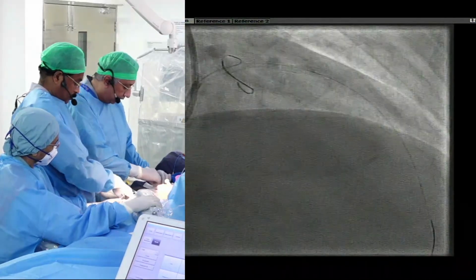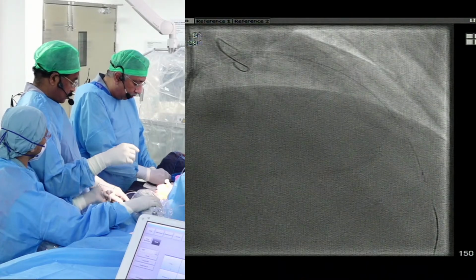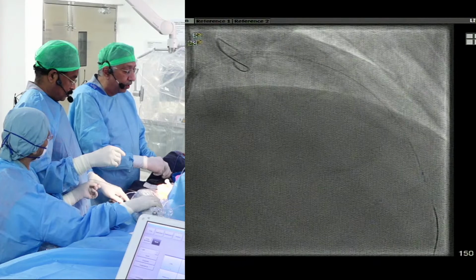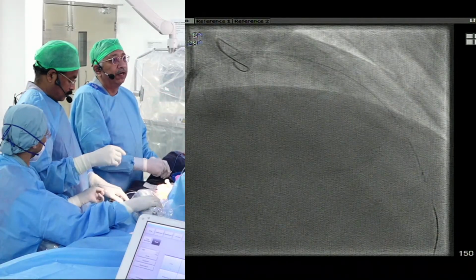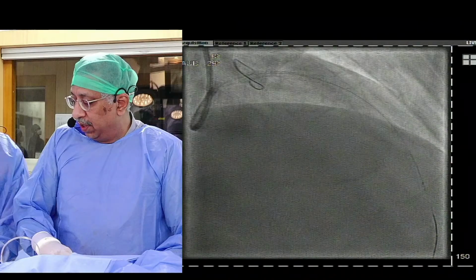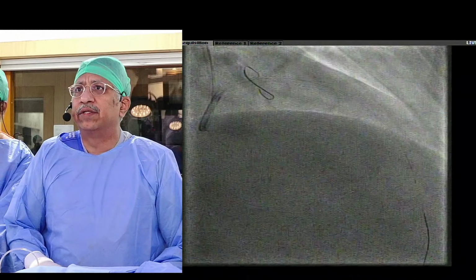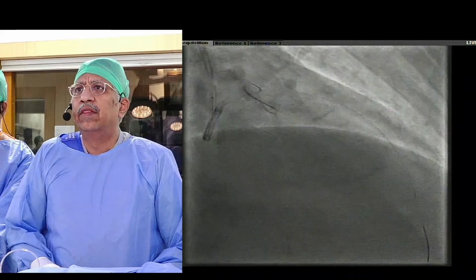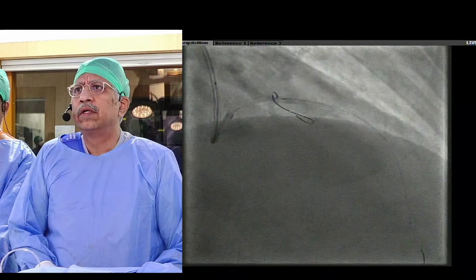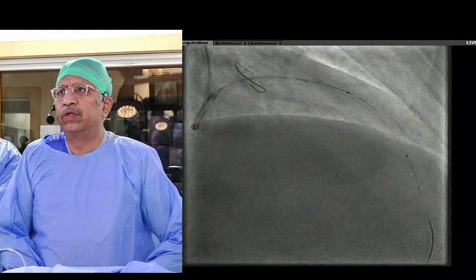Entirely agree with you on that. The catheter which we have right now is a catheter where the monorail part is a little flimsy, and you really find it difficult sending it into the circumflex. Sometimes you do find it difficult sending it the third or fourth time in the same case too. So right now what I'm doing is I'm just trying to send the OCT catheter into the LAD, and we'll do a shoot there.